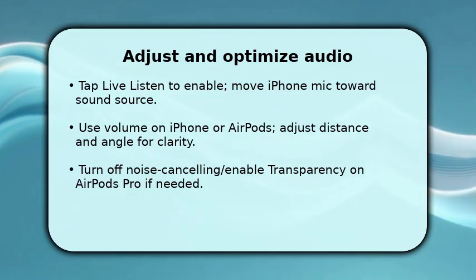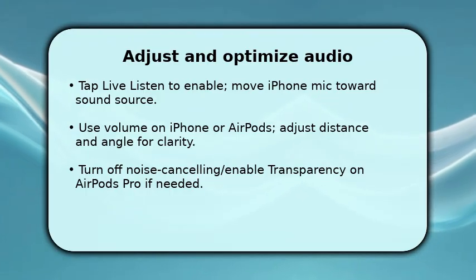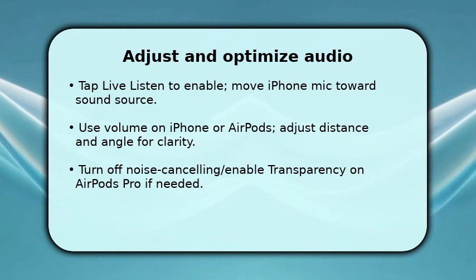If you have AirPods Pro, switch off active noise cancellation or enable transparency for more natural background cues. Make sure settings match the environment. These steps reduce echo and improve intelligibility, so you actually hear words instead of muddled noise.